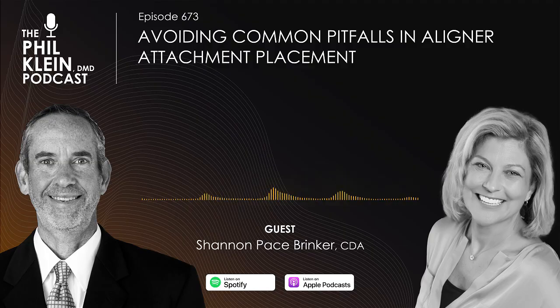We want to make sure first that we try in that template and that it fits. It goes down all the way. There's no space, or we call it daylight, where it sits way up and doesn't go down all the way. And then we want to try in the first aligner, because if I just take the template and go ahead and paste my attachments and I didn't try in the first aligner, what if it doesn't fit? How do we know which one could have been wrong? And it has happened.